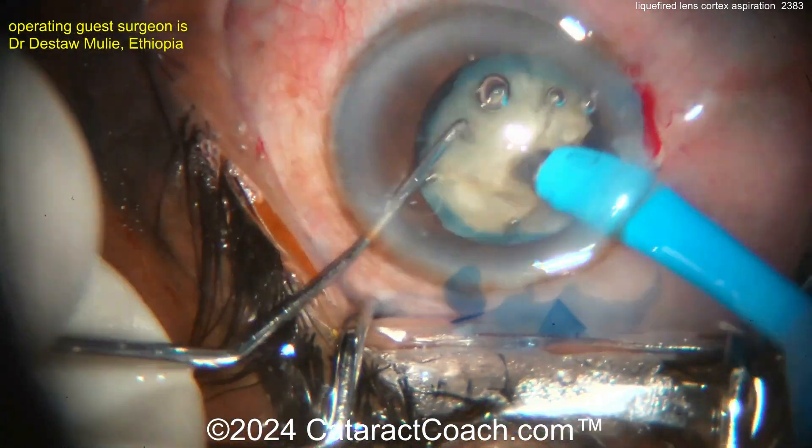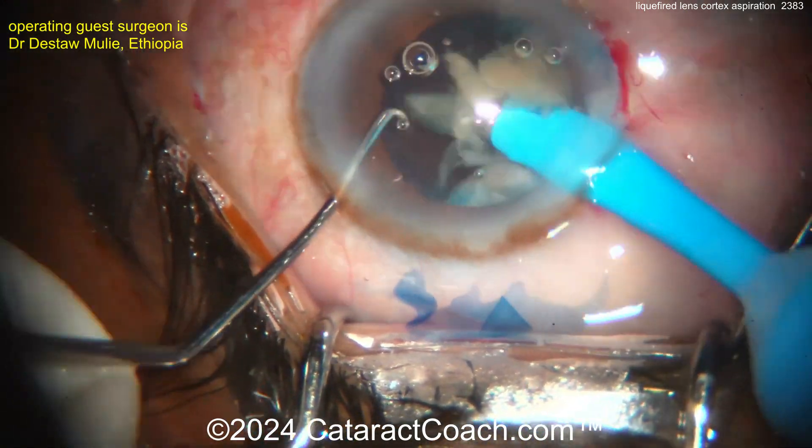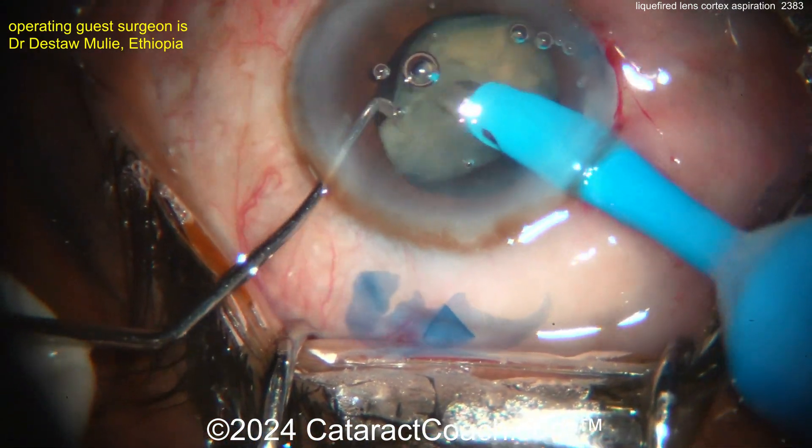It's not really this fast — we've sped the video up because we know our cataract coach viewers have short attention spans, just like me. Now going inside here, nucleus comes out. I'd put the chopper smooth end towards the posterior capsule to protect it as this last piece comes up.